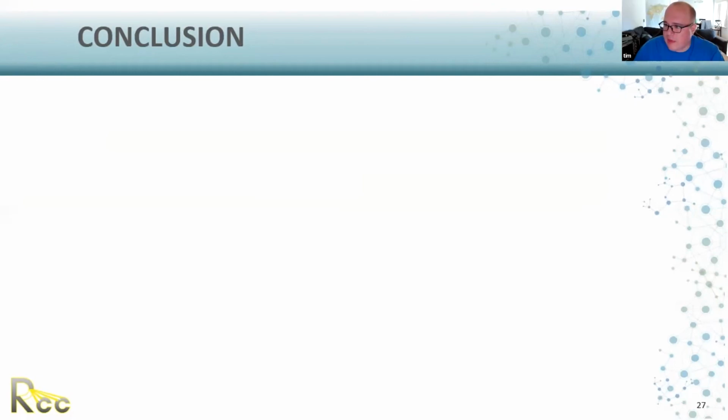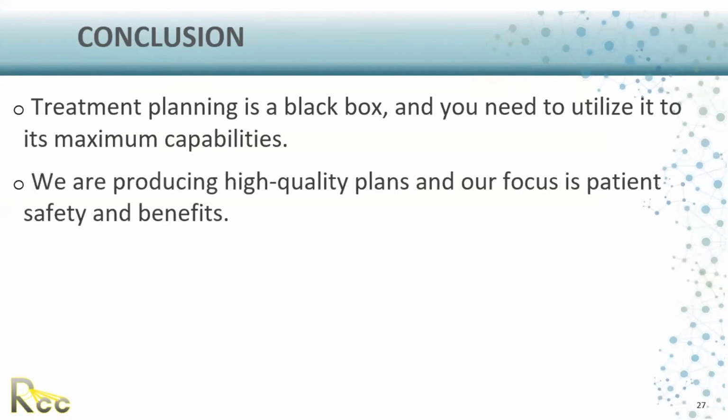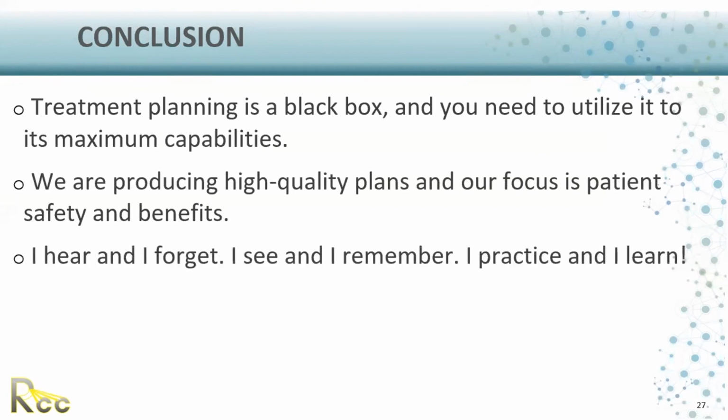Great. So with that, I will reach the conclusion. Treatment planning is a black box, and you need to utilize it to its maximum capability. We are producing high quality plans, and our focus is patient safety and benefit. And I would like to recall this saying: I hear and I forget, I see and I remember, I practice and I learn. So I advise people, practice, practice, practice. This is how we learn.